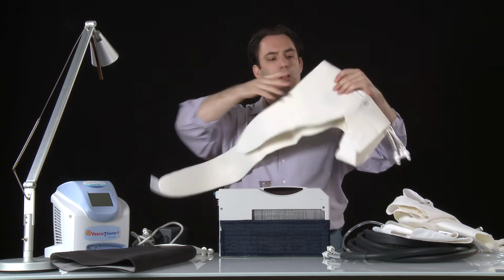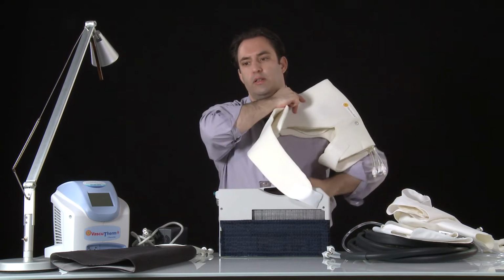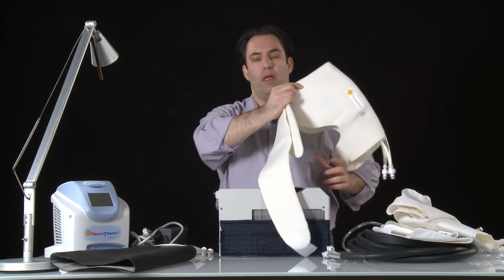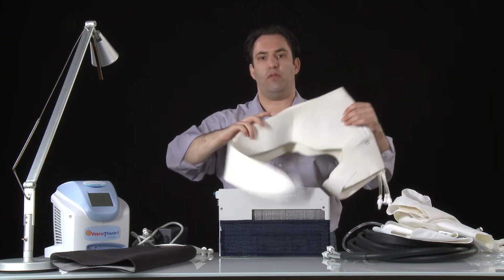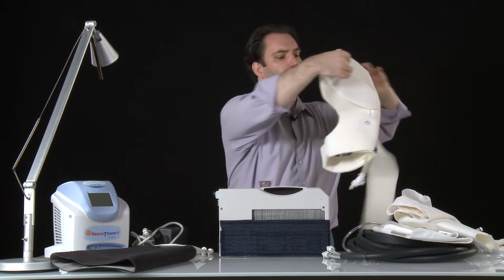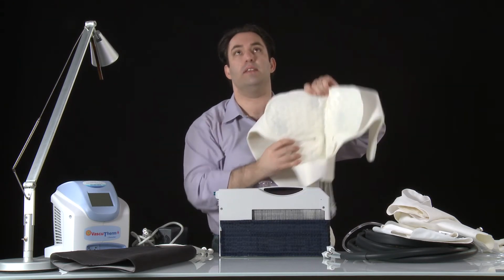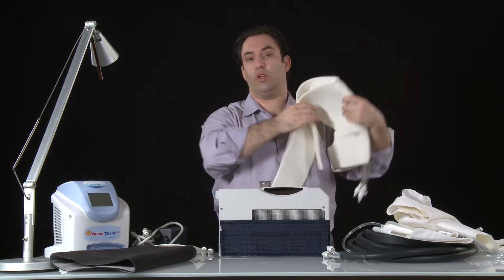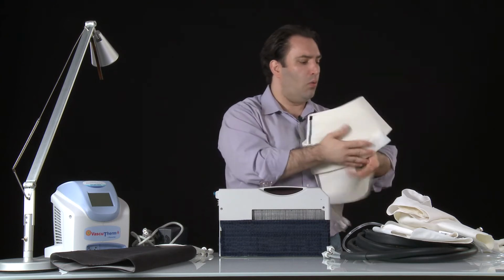This is a shoulder. Right now, it's a left shoulder. You can imagine the lower strap would be coming underneath my arm, or it may be tacked to the front and the back if you've already got yours on. Similar sort of a butterfly, very straightforward. There's a few different sizes, and it's great, really, really helps people.